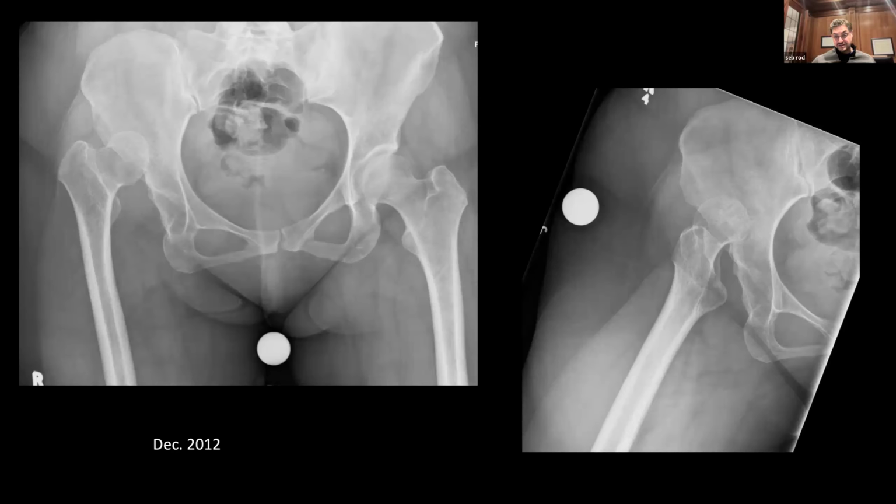Personally, I do these from the anterior approach. Actually, we have a little case series. To be honest, with the posterior approach you have to strip all the capsule, and these become slightly more unstable. So I like the anterior approach for a variety of reasons. One, they're supine on the table. You have fluoroscopy there. My cup is going to be perfect because I can ream it.